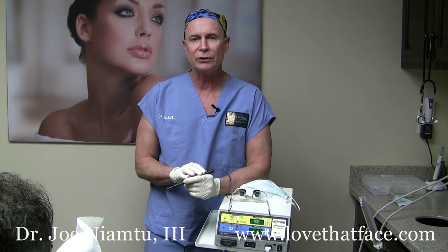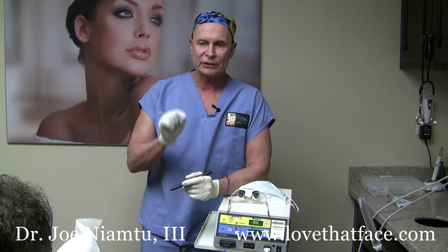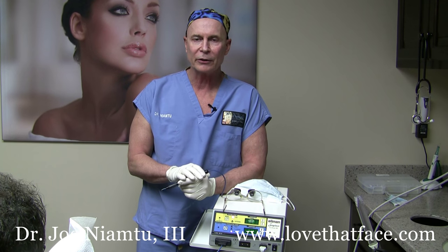With this machine tuned to the proper settings, you can really do this without any local anesthesia. You just don't want to stay on the skin with a long contact time, and we're going to do this on an awake patient and we'll talk to him as we're doing it.